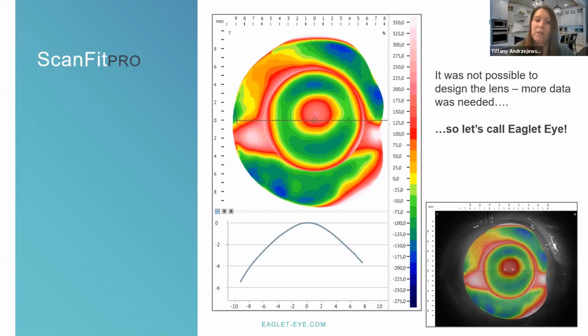So I discussed various options with him, and we were looking at maybe doing an eye fit or an eye print on his right eye because of the extreme elevations and differences. What ended up happening is Christine Sint asked me to see how this patient would do with a ScanFit lens. So long story short, we had him stay out of the lenses and did a scan of his right eye. After probably 15 tries of acquiring a decent image, this is the best I was able to get. And I think at the narrowest side nasally, we were at about 7.4 millimeters.